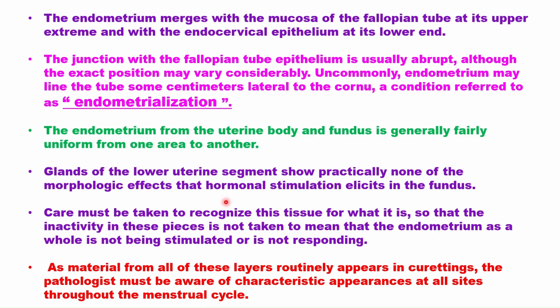If we receive an endometrial biopsy from this segment, then we may mismatch the date because of its unresponsiveness to hormone stimulation. And in general, we are receiving material from all these layers routinely, so pathologists must be aware of the characteristic appearance at all sites throughout the menstrual cycle.